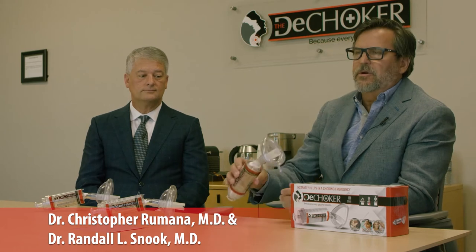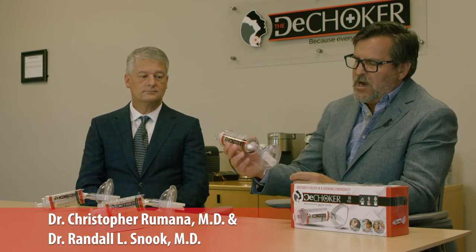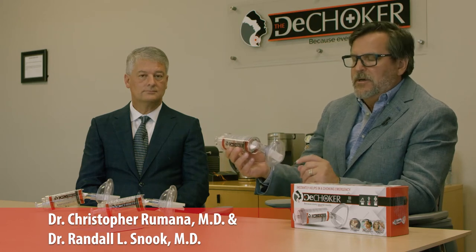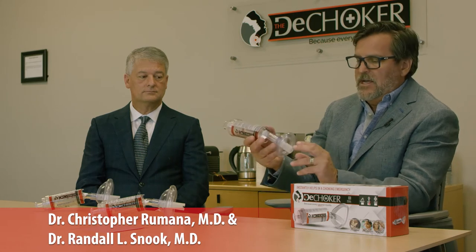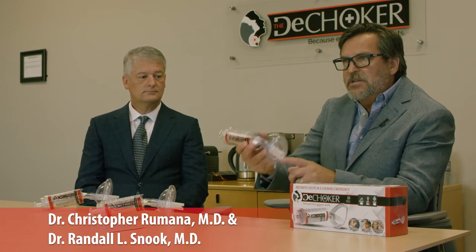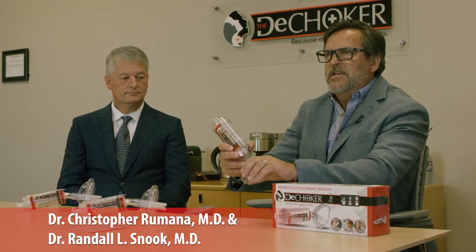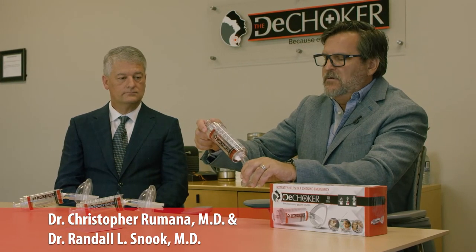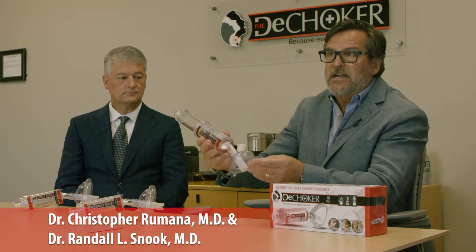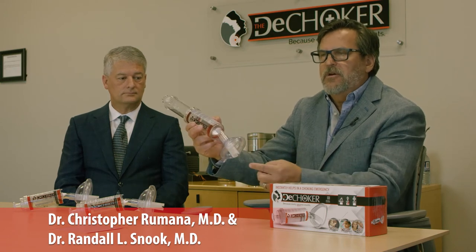The mechanism behind the DeChoker is extremely simple. As described, it generates a negative pressure. The most important part is getting a seal around both the mouth and nose. The portion that comes out pushes the tongue out of the way. As you place this over the mouth and nose and form a tight seal, all that's left is to pull back on the mechanism and generate that negative pressure, which pulls the obstruction out of the airway.